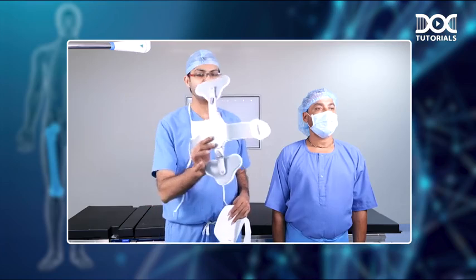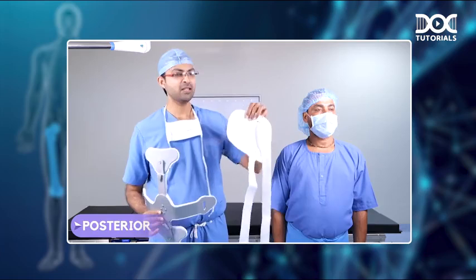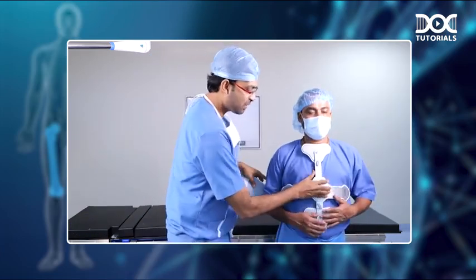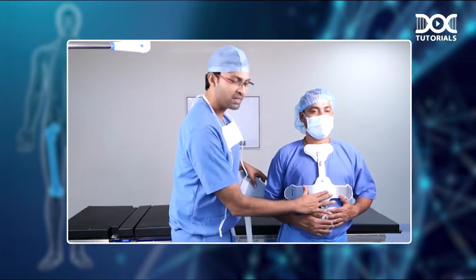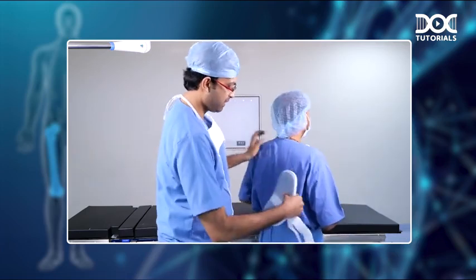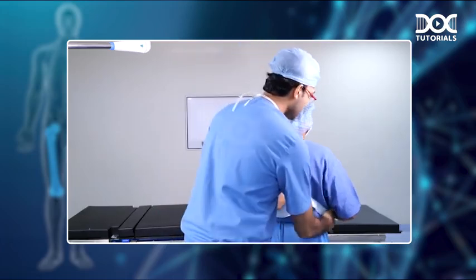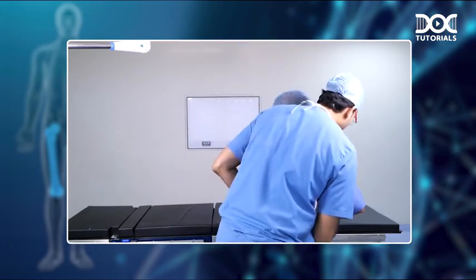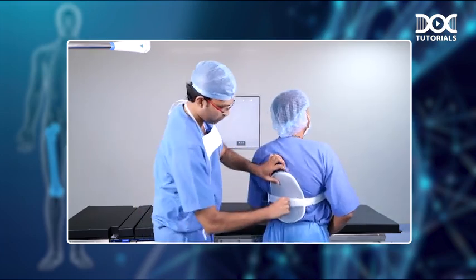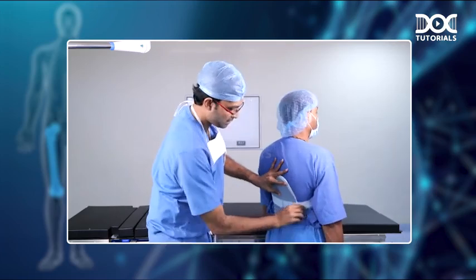So this brace will have an anterior part like that, which is more important, and it also has a posterior piece like this. So it is very easy to apply. You can ask the patient to apply it like this. You just ask the patient to hold on to the brace for some time. Then you ask the patient to turn around. Then you can keep the posterior splint like this, and there are straps available in the front which you can apply. Make sure you tighten it on both sides like this.